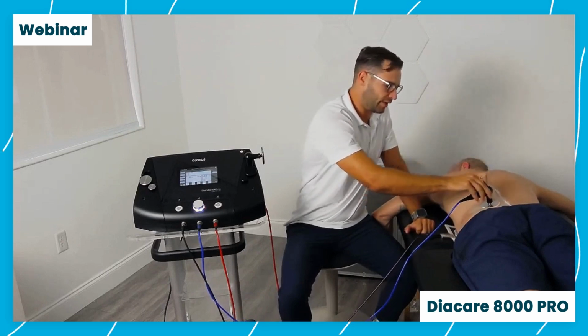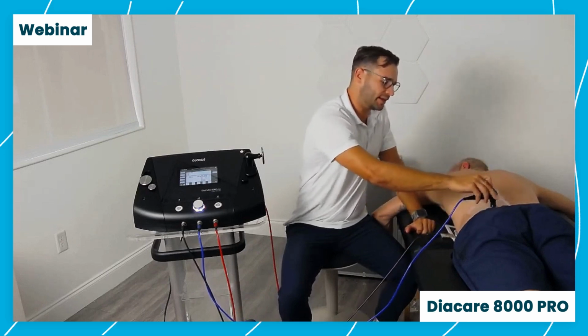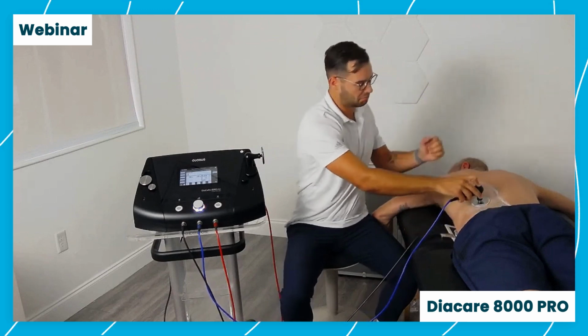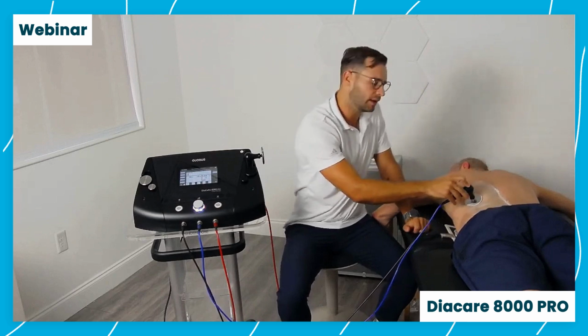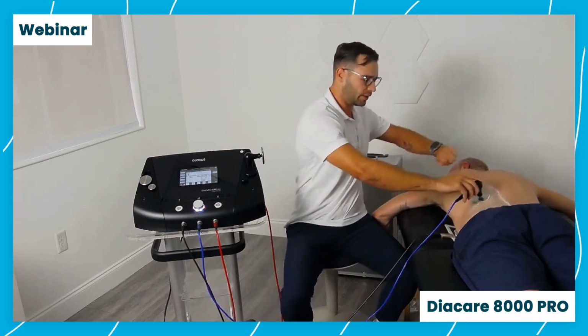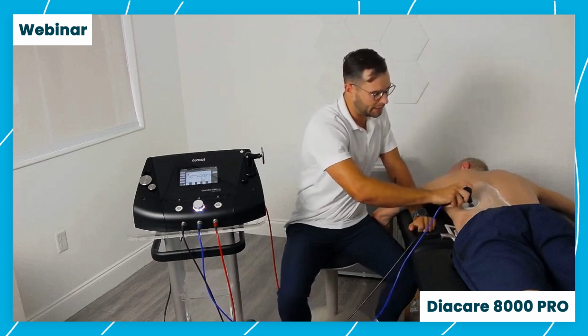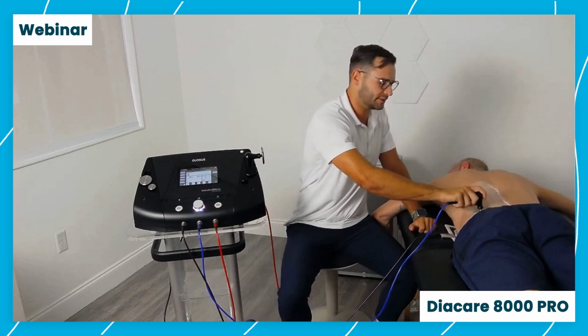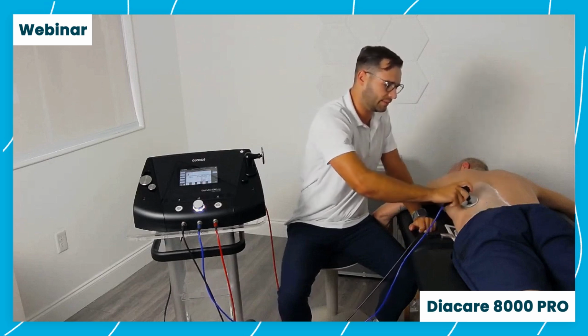We also have one of our favorite things, our fascia tools. We can hook up pretty much an instrument-assisted soft tissue management tool directly to the Diacare 8000 machine, and we can be going through that soft tissue manipulation at the same time as we're generating the Diacare and generating the heat within the body here.